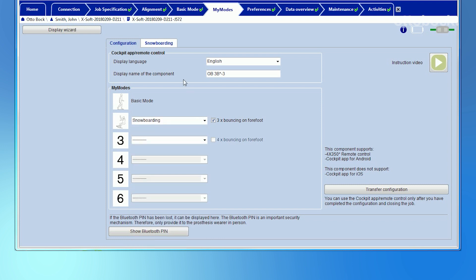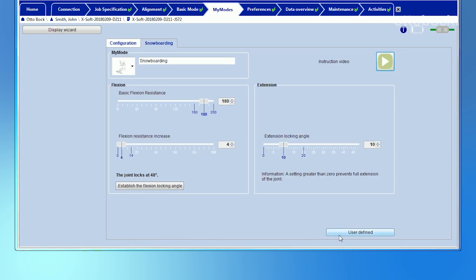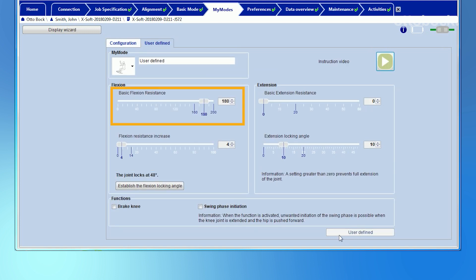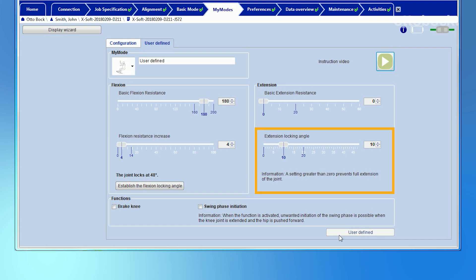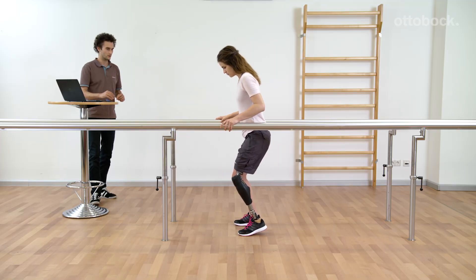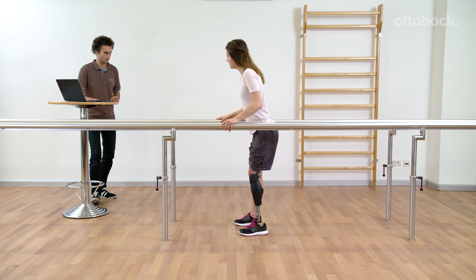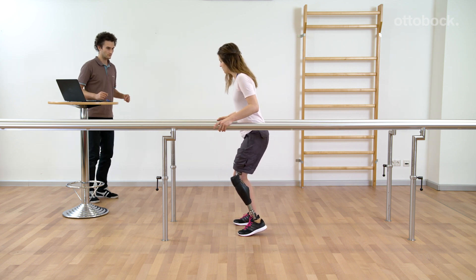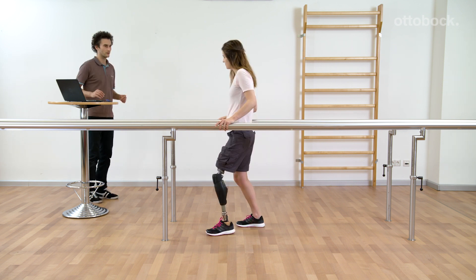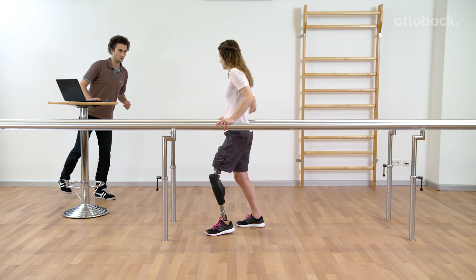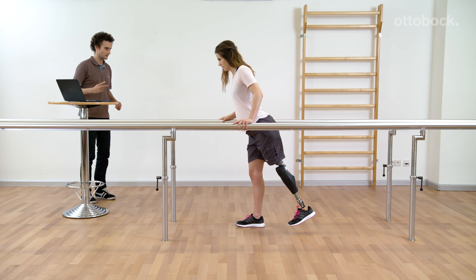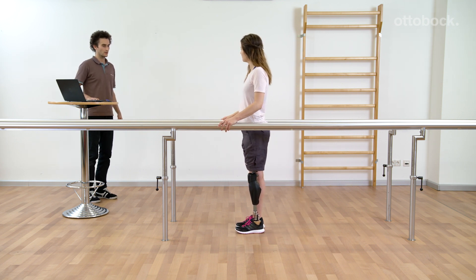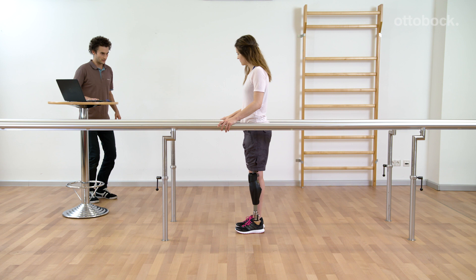The next example is the Snowboard My Mode. The flexion locking angle is set to 48 degrees in the preset. The high basic flexion resistance should improve the control of the snowboard. The flexion locking angle and the extension lock at 10 degrees ensures that enough heel and toe pressure can be applied to the board and should provide relief to the residual limb muscles. Every turn can be taken with confidence and in a relaxed manner with these settings. To stand upright after unstrapping the snowboard, the extension lock can be released by holding the prosthesis back and in the air for 2 seconds. The mode has to be switched back into basic mode before walking. It is not recommended to add the stance release function to this setting. If the knee joint bends just a little bit during loading response, stance release will not be possible for that step.